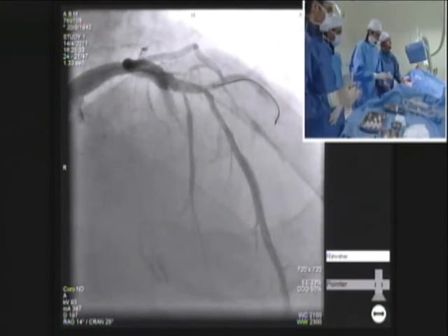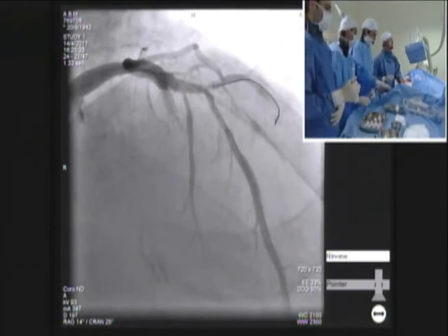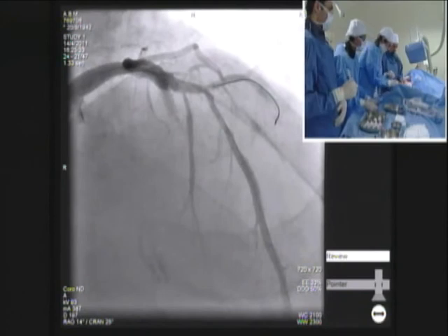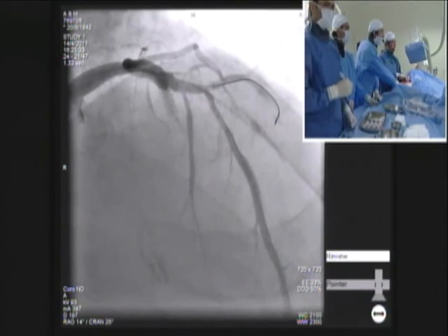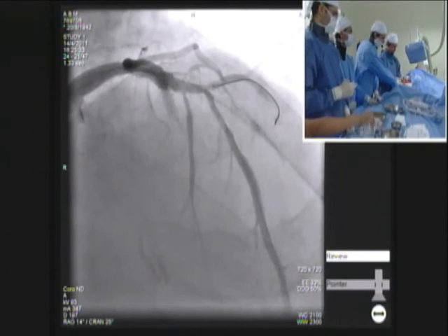So let me just do a very quick exercise with the panelists. What do you think should be the length of the lesion based on angio? If everyone can pick up the stent 3.0, what is it going to be? 12, 15, 20, 28, 32? Give me just the number. I just want to see if there is consensus. 30. 30. Okay. 32. 32. Okay. 28, 30. I think it's quite about what balloon size you use as far as length. The balloon was 20 or what? 20. 15? The balloon was 20. 24 or so, something like that. Okay, so we have a range from 24 to 32.